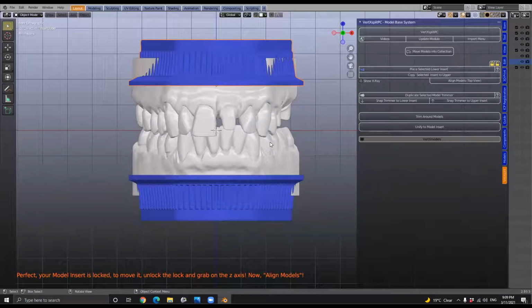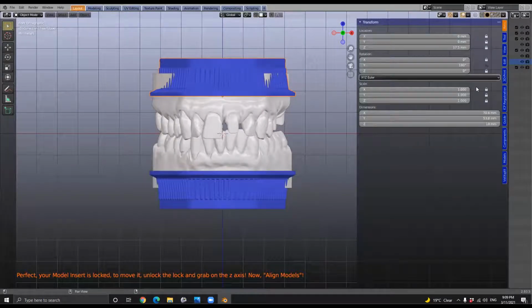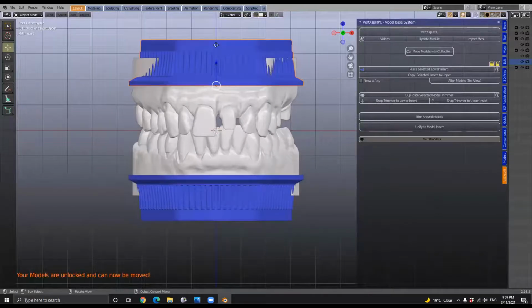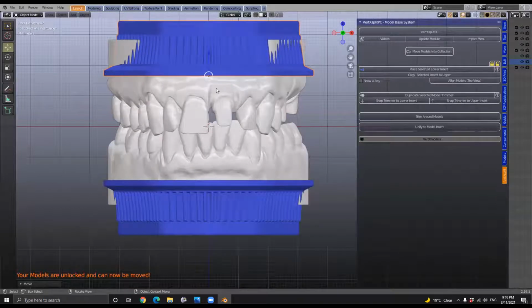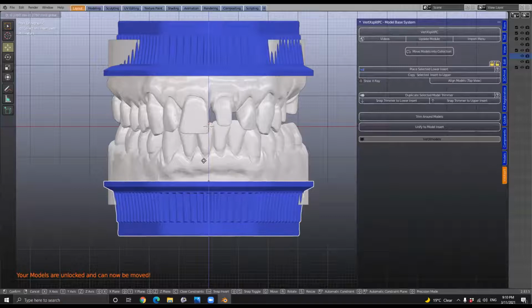It comes in the front, and then we've got these locks. As we know with Blender, we've got these locks in the item menu over there, but we can easily unlock it. So if I unlock it like this, I can move this up and down. So we get to choose how long we want the dies, and I'm looking at this specific portion over here and over there at the back. The same thing on this side, we can unlock it, and we can lock it. Ideally we want to keep it fairly short.